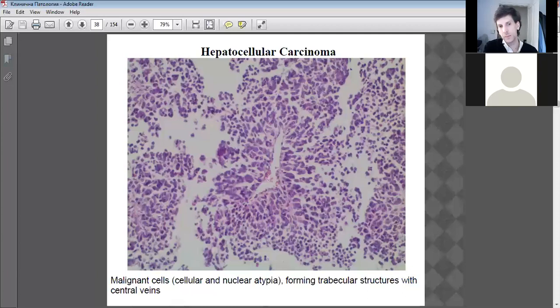It has collapsed on itself, but notice the big spaces and the abnormal cell division. See, the abnormal cell division, it's all haphazard, if you like. It's not grouped together as a tissue, it's all haphazard. And that is typical of carcinoma, if you like.